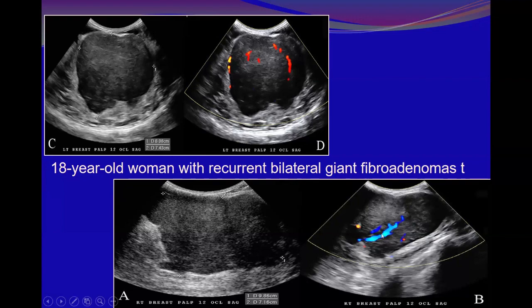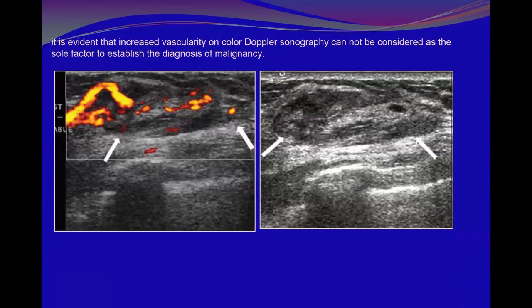In this case, you see, the vessels are reassuring, though it's coming. Here I have seen it inside the lesion without seeing capsular vessels. Also, these are suspicious types. I could see it within this one. It can be considered as probably reassuring, but intralesional vascularity, and even multiple interrupted like this, are relatively non-reassuring features.